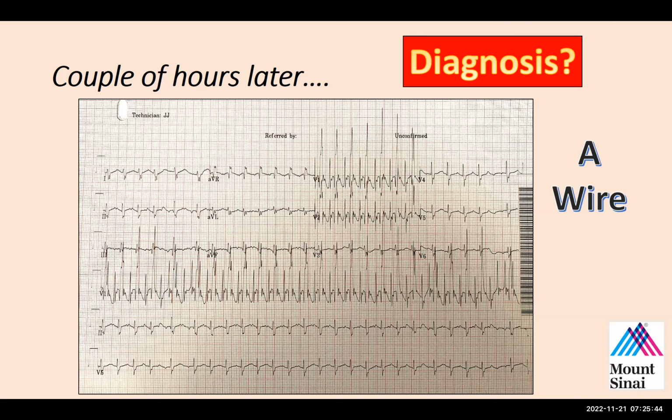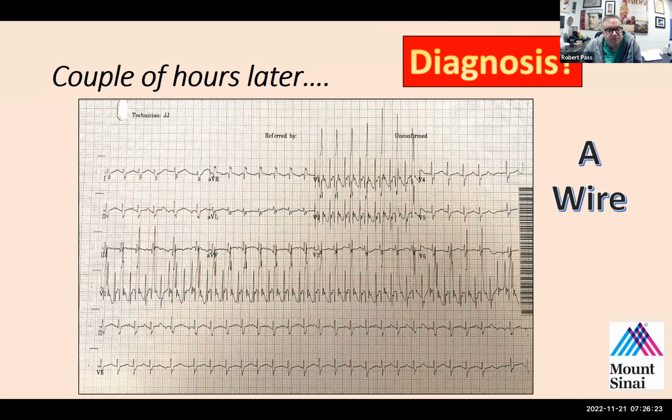Sure. Just going back to the open chest with the synchronized cardioversion, would you always recommend going with the higher energy? Yeah, I think so. Now, it would not have surprised me if it didn't work. If it had not worked, then I would have probably tried A-pacing, but I would have let the surgeon know in advance because it could have potentially caused a problem. If I cannot cardiovert externally, then the only way to cardiovert the patient would be with internal paddles. And since I'm not a surgeon and I don't have access to that, I didn't want to get into that unless I knew the surgeon was either there or available.